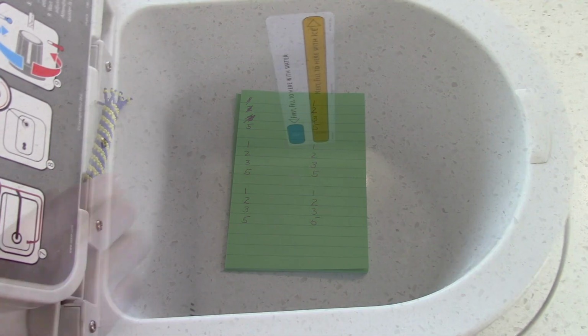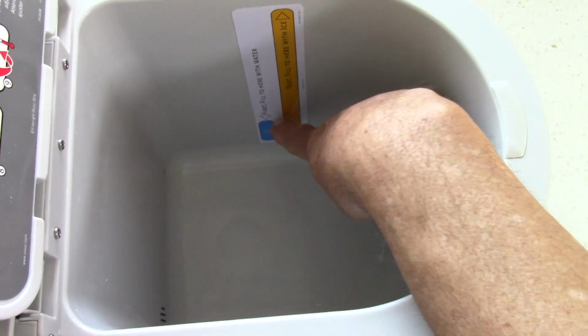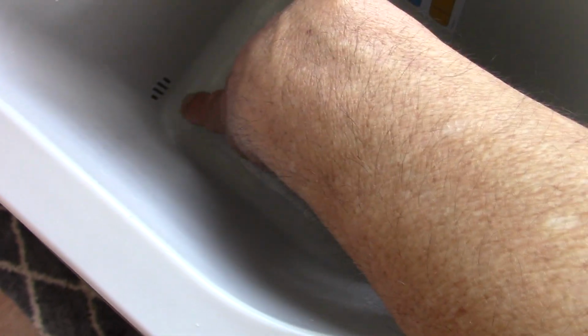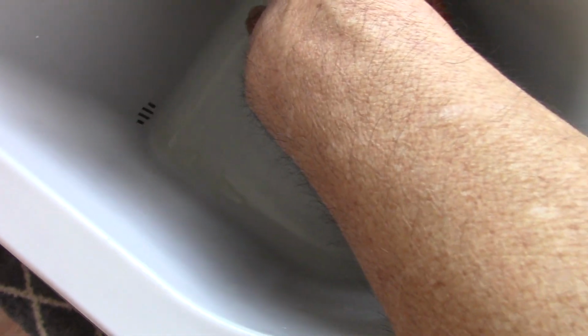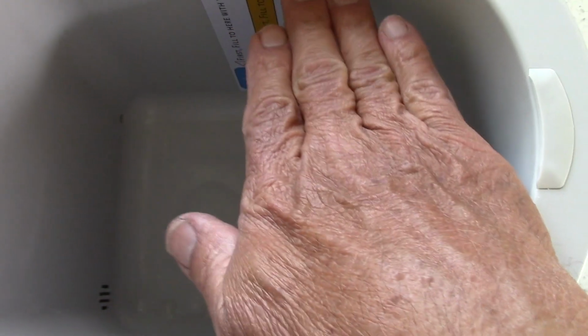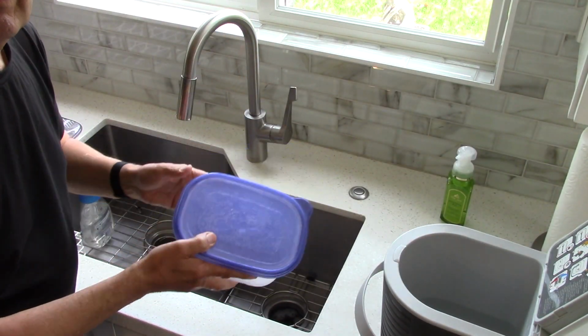pair of blocks. Looking into the tub, I'm sorry about the wobble, you fill it up with water to this line, and you can see if I turn it around this way, you can see the 2 ports, the entry and exit port for the water, and you're covering those when you fill it up to that line. And then you put your blocks of ice in here and it'll bring the water up about that high, and you're ready to go.